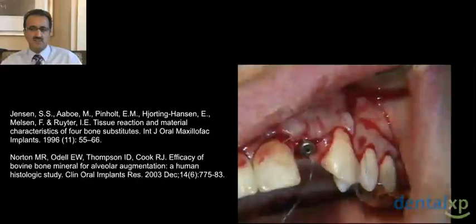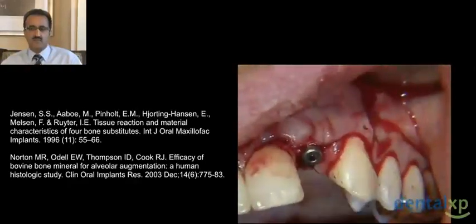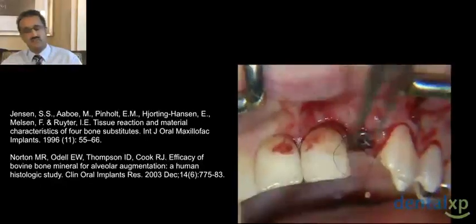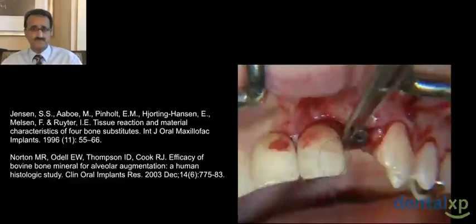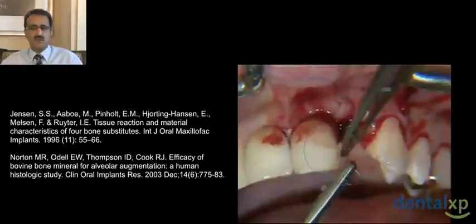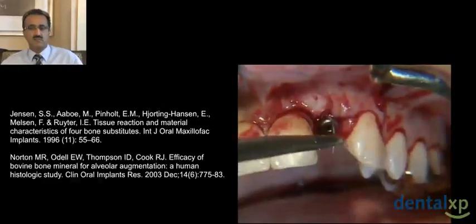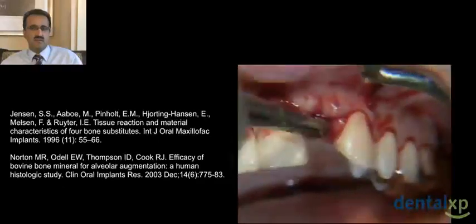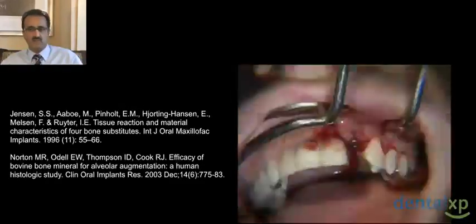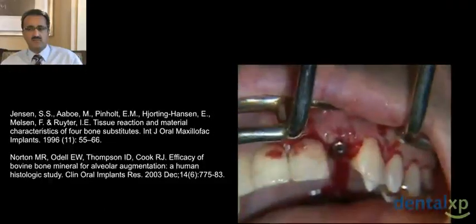So then we pay attention to detail, suturing this flap very carefully. I'll just let you spend a little time to see how we can suture, and you see how nicely the flap adapts together. And just taking time to really precisely position all the tissues where you want them to be, so that we can end up with a nice outcome and a nice result. So as you see us doing that, we can get a pretty nice result there.